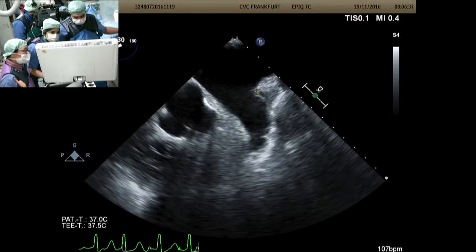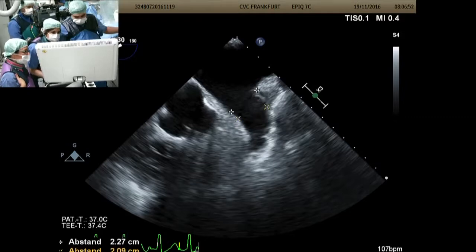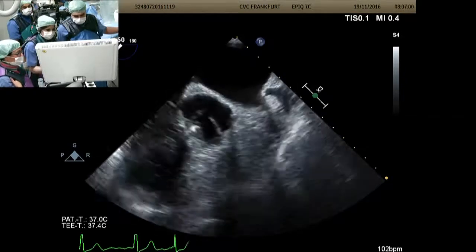So if we measure the orifice at the top here, something like that. And what does that come out as? 23. And then if we were coming a bit further down for where we think the orifice might be, maybe here. I'm not quite sure in this view because I haven't got good landmarks. It's not a view I'd always rely on for the measurements. As I said, I use 3D, but that's the first view.